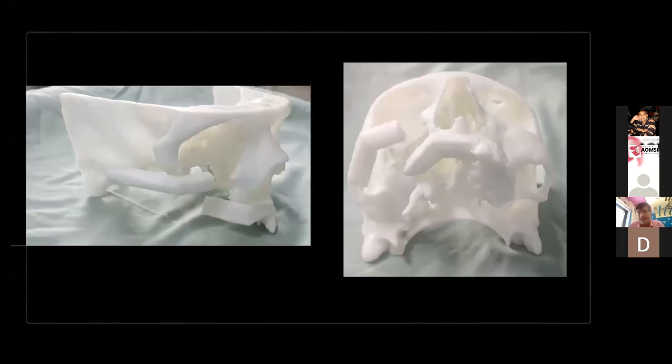To start with, this is a case with a unilateral right-sided total radical maxillectomy with loss of the infraorbital rim and zygomatic bone, where the zygomatic prominence and arch were both removed. We did a CT scan and 3D virtual surgery planning for the patient, and came up with a plan of a 5-segment osteotomy in which one segment will be removed for the jumping distance. The first and second segments will form the zygomatic arch and prominence, and the third and fourth segments will form the maxillary alveolar arch. This was the basic surgical plan.